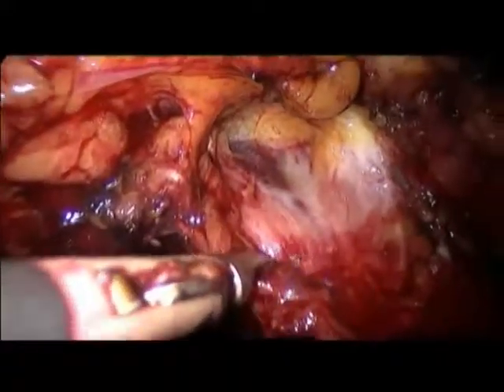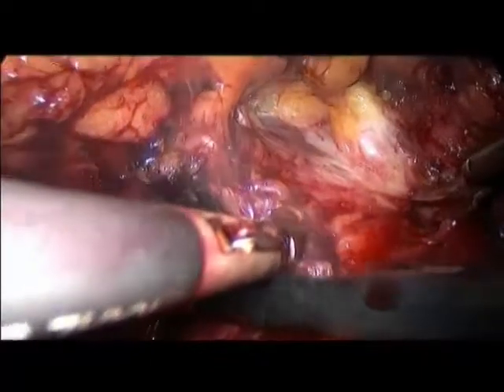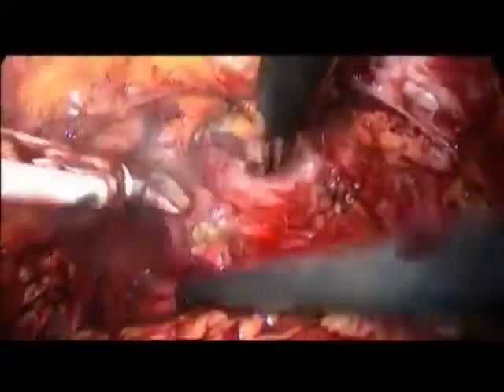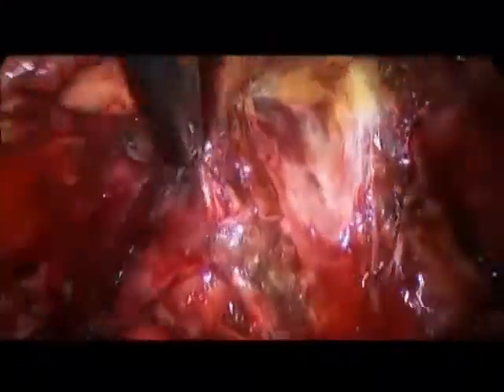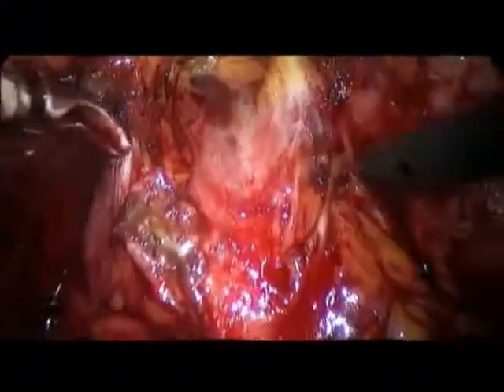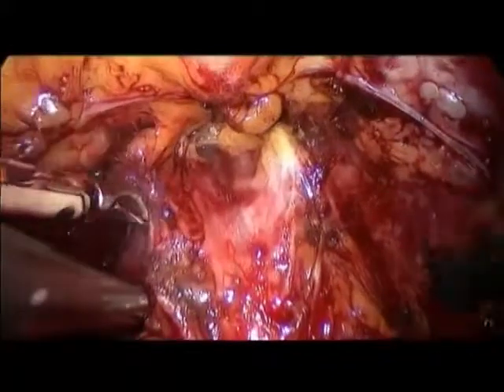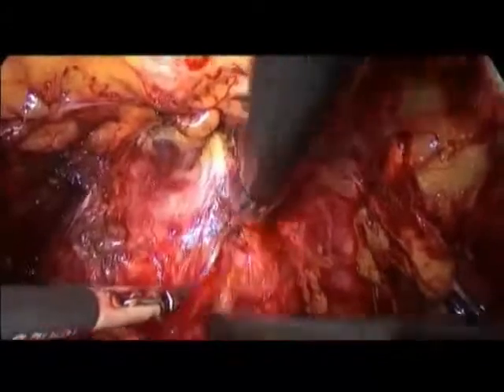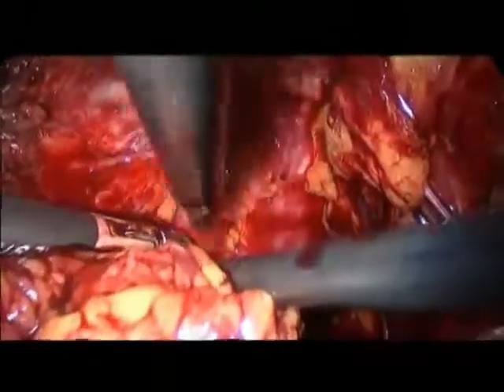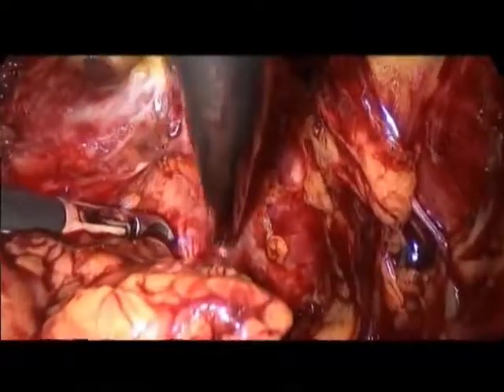We have also to keep in mind in this patient that we have mainly an anterior tumor as shown on the MRI, and we have a very large covering of the apex with this structure containing the Santorini and limited on each side by the puboprostatic or even pubovesical ligaments, as said by some of us in the literature. So we can do the same maneuver on the right.